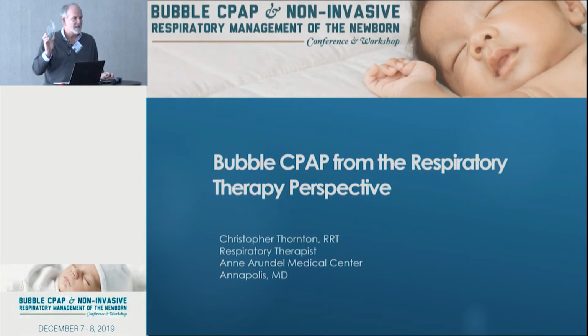We could use this to create the bubble CPAP endpoint, okay? Most of you have something plastic probably on your desk. The water bottles are a little small, but they could be made into this. And that's something when we did a lot of teaching with nurses, they would fly in from foreign countries, and neonatologists from foreign countries.